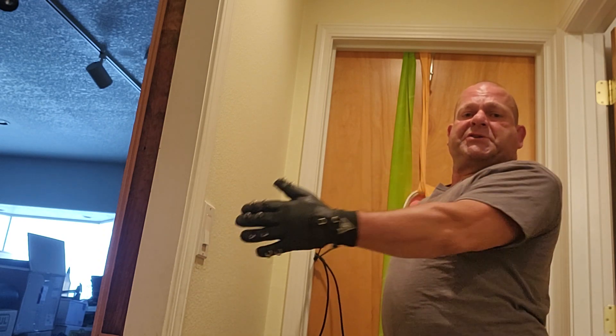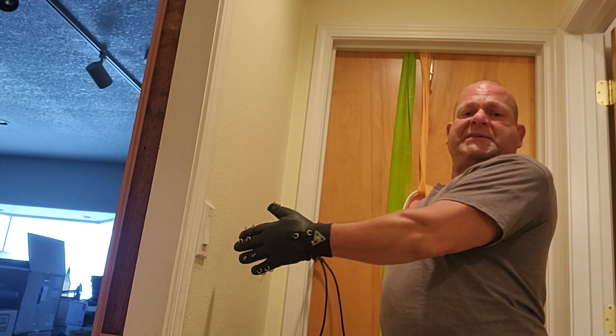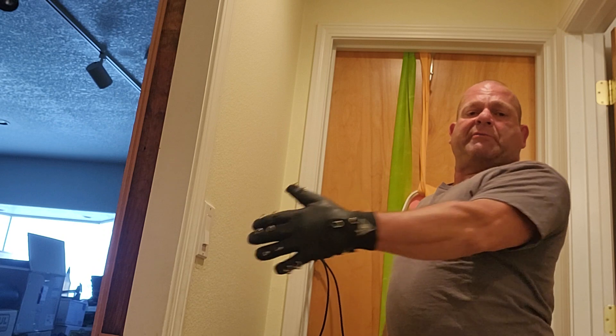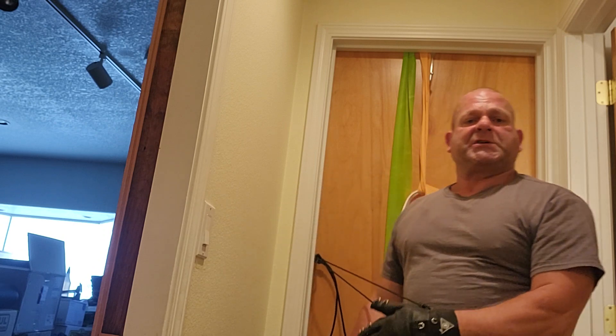This is a horizontal extension using the Flex-In AC kit attachment to the Flex-In Restore orthotic glove. Thanks a lot and have a great day.